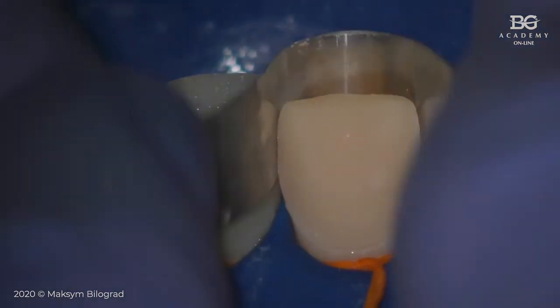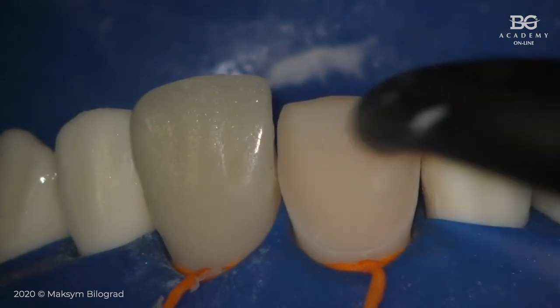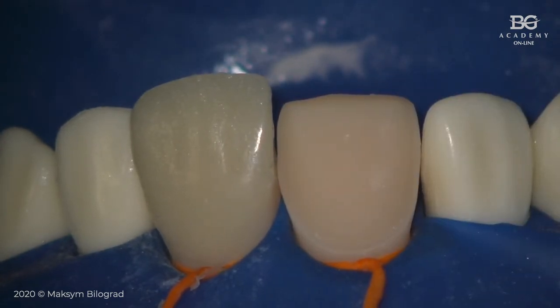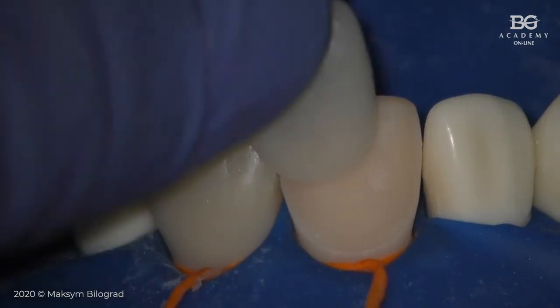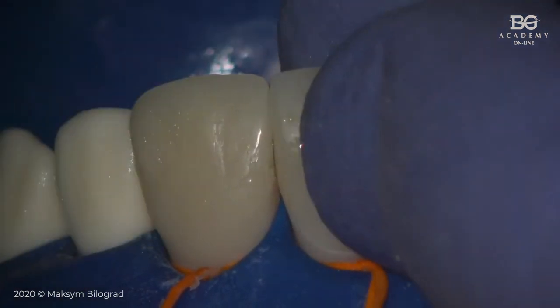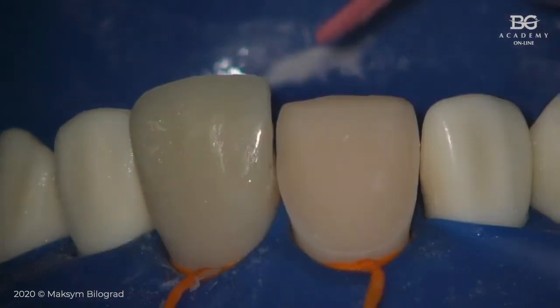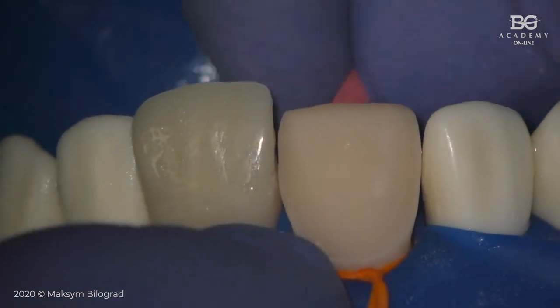And after this, I will remove my metal band, I will dry everything, and I will try in my veneer. In this case, I will have some problems with proximal contact. So what do I have to do in this case? In this case, I have to take a wedge. I will put the wedge from the palatal side.